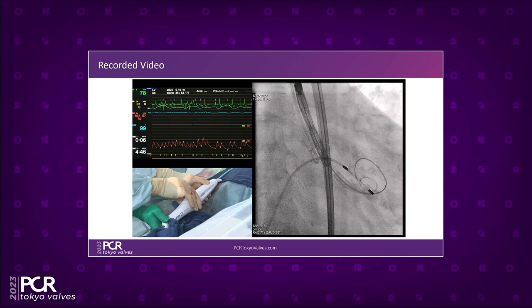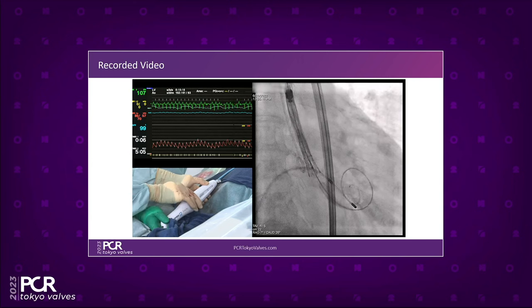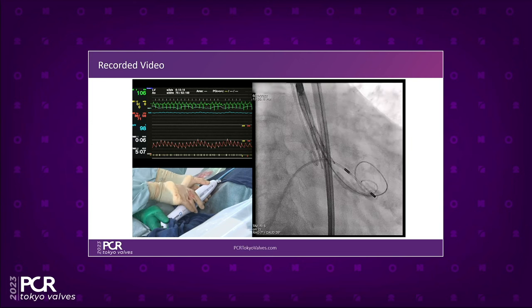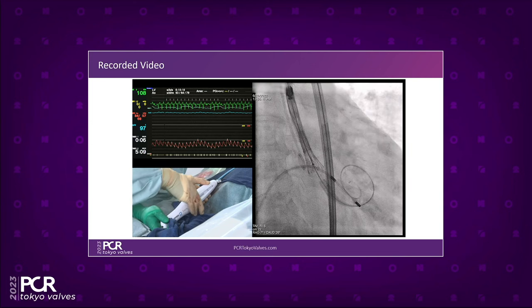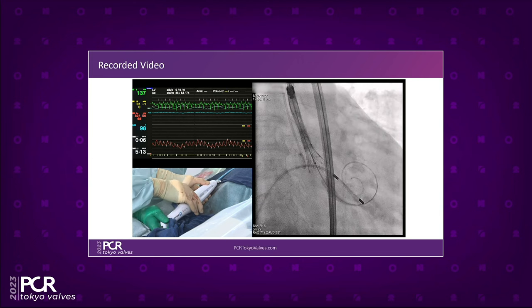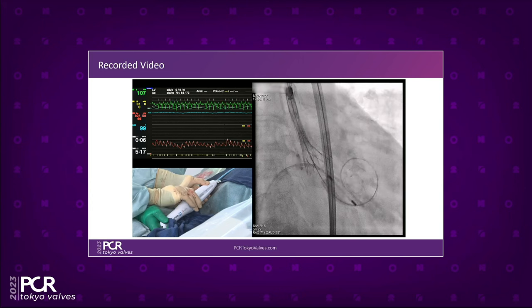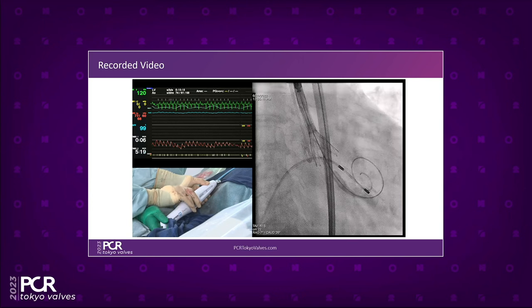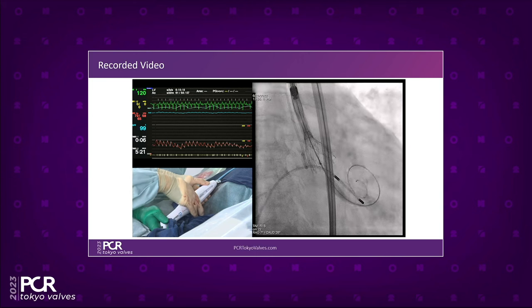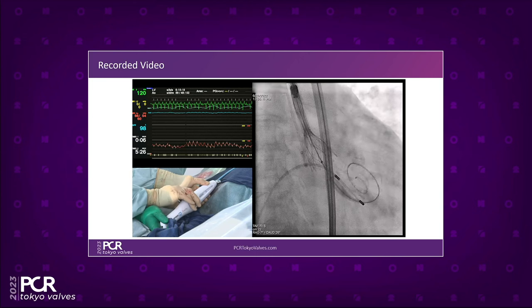But nowadays, we tend to open up the stent frame inside the left ventricle and then pull back. That makes the incidence of non-uniform expansion much lower in our center. And quite interesting, Professor Kentaro does the pacing. Yeah, I like pacing because we don't have anything to lose by pacing.